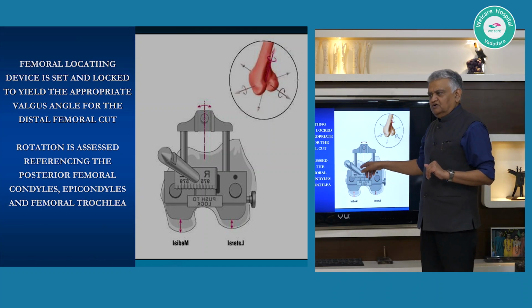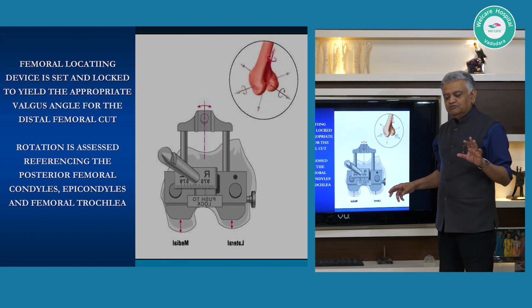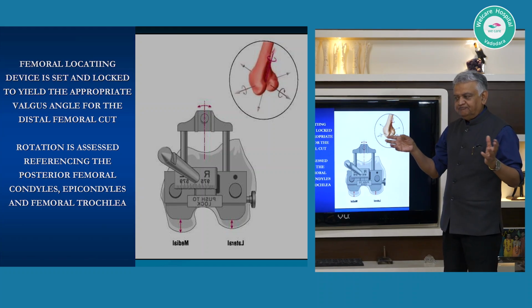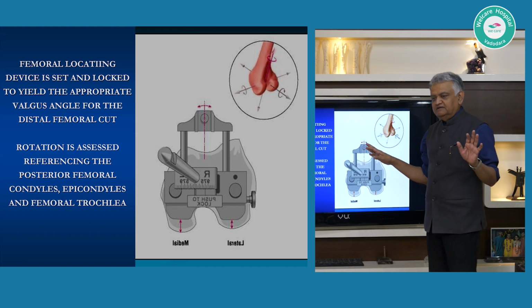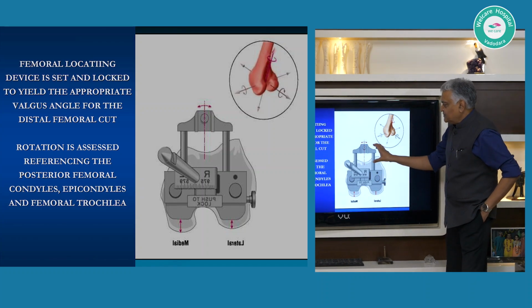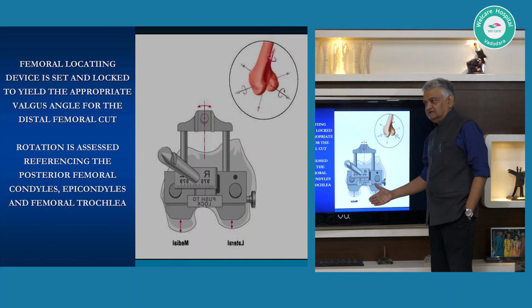Here there is no slope on the distal femur unless you choose to do it as an intentional matter, because when you go into the nuances of discussions of functional alignments, etc., you are talking about incorporating a tilt in the sagittal plane as well. But clean your mind of that, and we will talk about it later. So at the moment, if it is a 90-degree cut, this rotation in itself is of no significance as far as the distal cut is concerned.